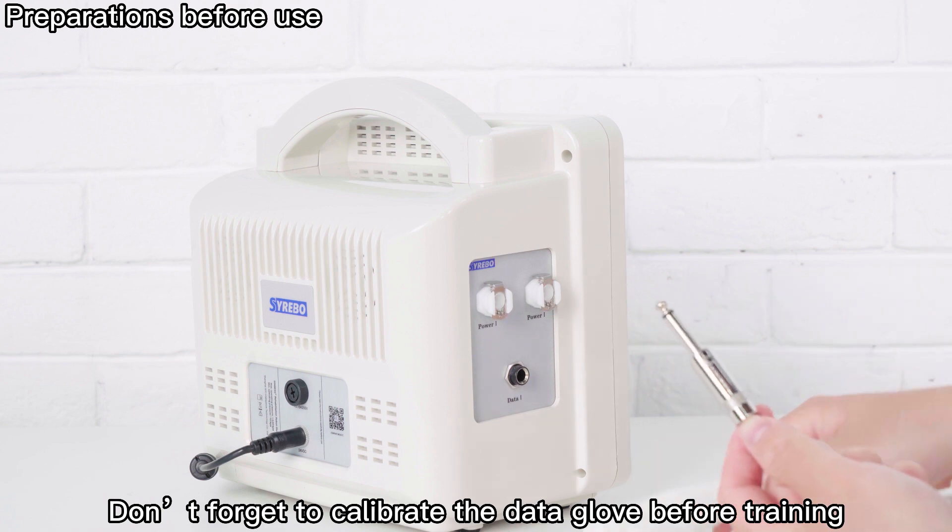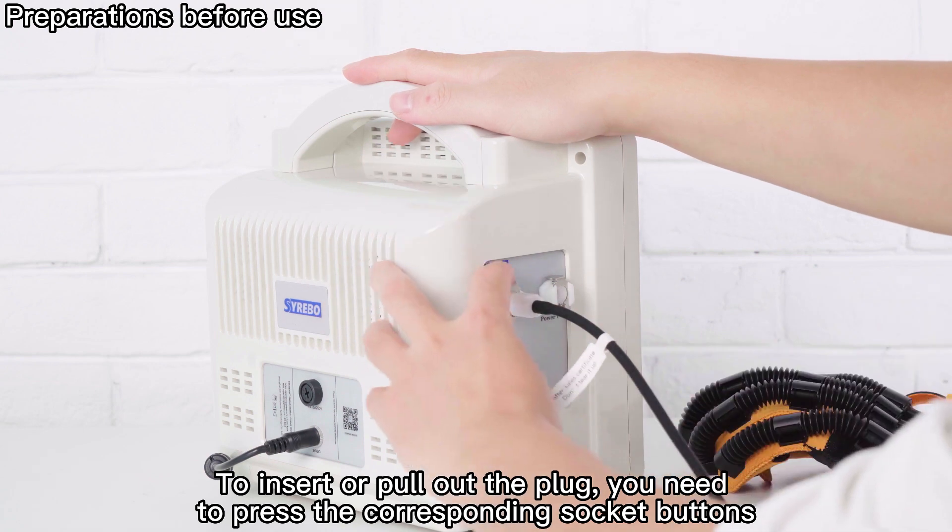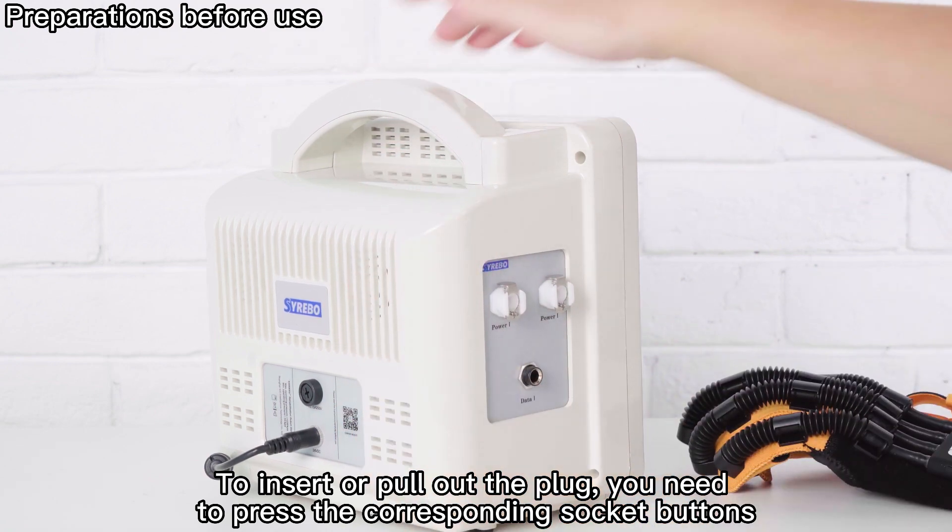Don't forget to calibrate the Data Glove before training. To insert or pull out the plug, you need to press the corresponding socket buttons.